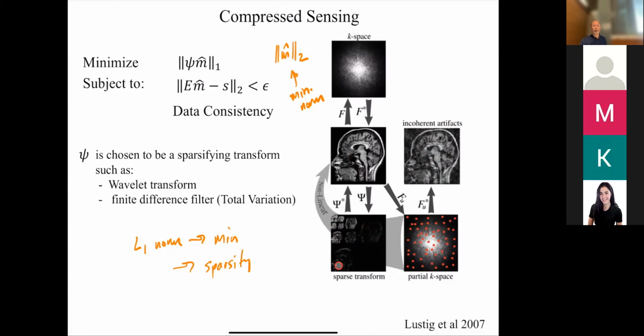Okay, so basically, and this is for the pre-lecture quiz, one of the questions is going to be about compressed sensing. And so the intuition you want to have is the more structure there is in an image, the more easily you can compress it, right? And so compressed sensing should work out. The more noise you have in an image, the harder it is to compress it, because it's hard to sparsify noise. Random noise is just hard to represent with a limited number of coefficients. So when you're looking at your options on that pre-lecture question, you want to think about which of these images has the most structure and the least noise, okay? And that will tend to give you the right intuition.